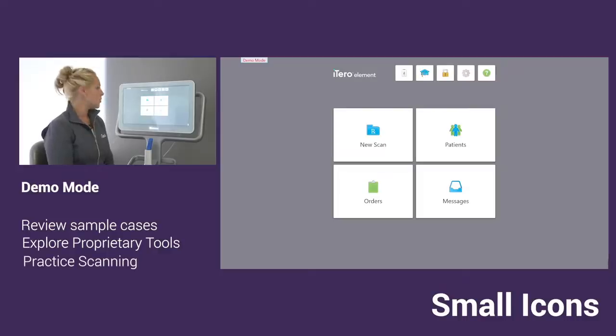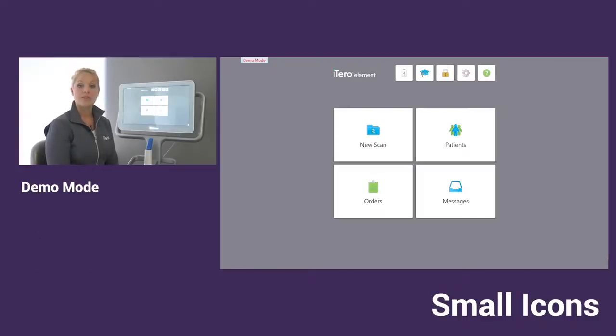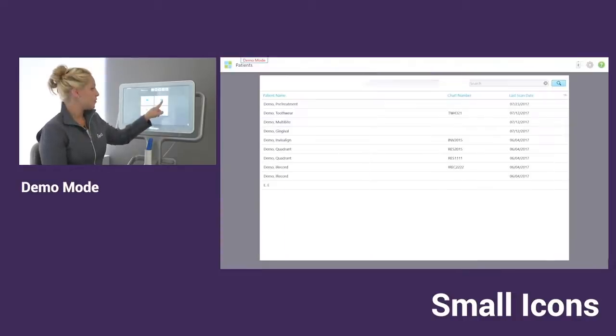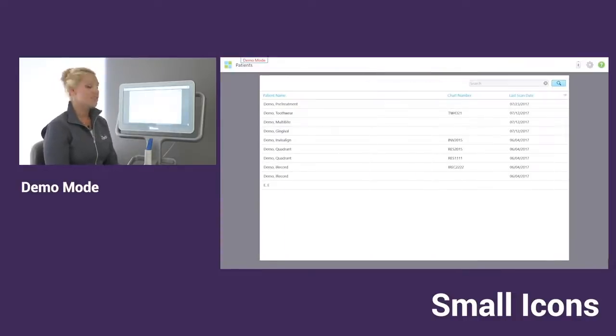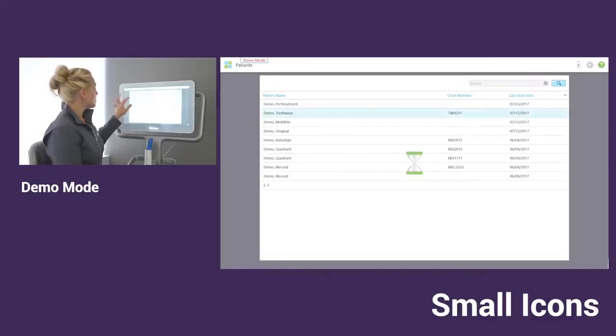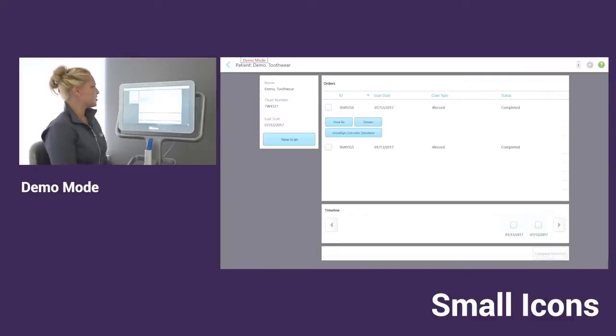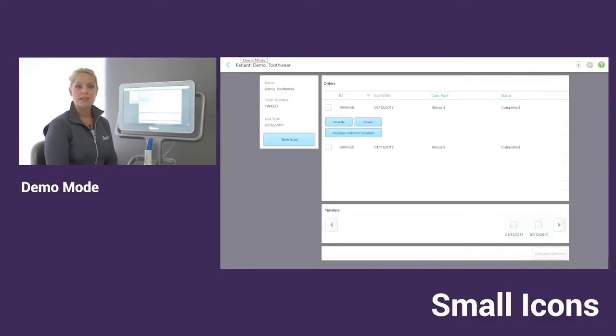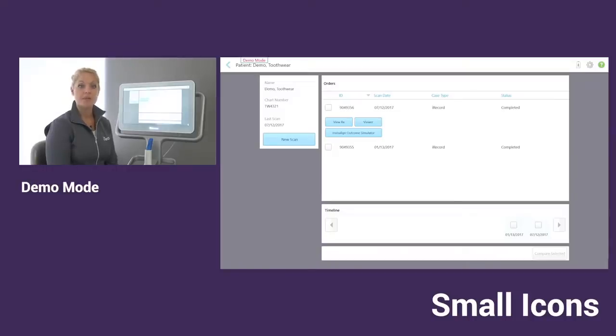So one of the things just to show you, as far as our cases that we already have preloaded, those are located in our patients icon. If you ever did want to run some of our features like time lapse or maybe the Invisalign Outcome Simulator later and just become more familiar with that, you can do all of that while in demo.